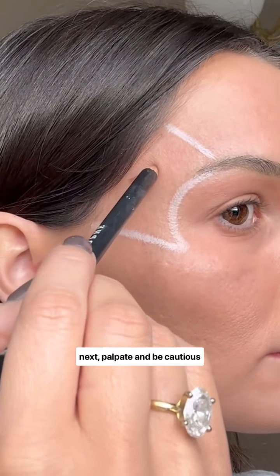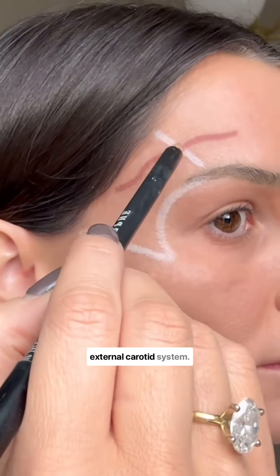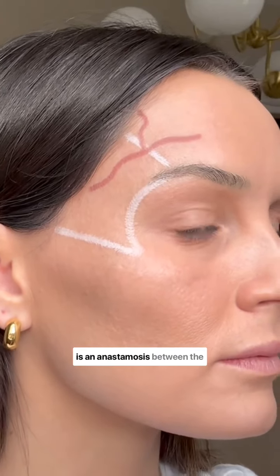Next, palpate and be cautious of the superficial temporal artery, which arises from the external carotid system. The superficial temporal artery has a frontal and a posterior branch, and it's important to note that there is an anastomosis between the frontal branch and the supraorbital artery.